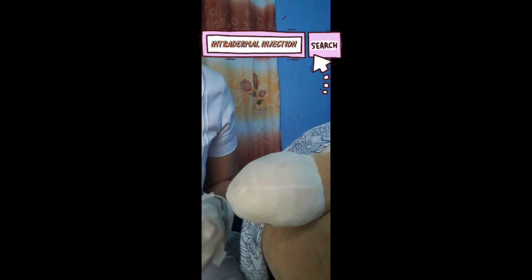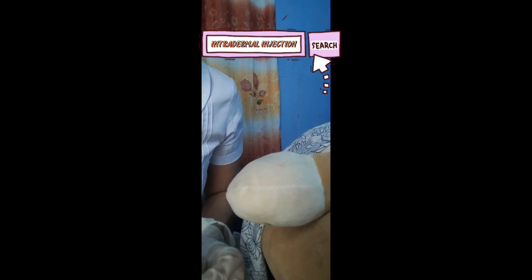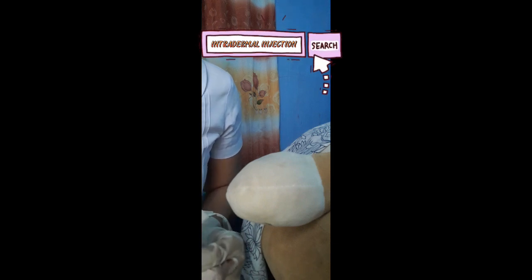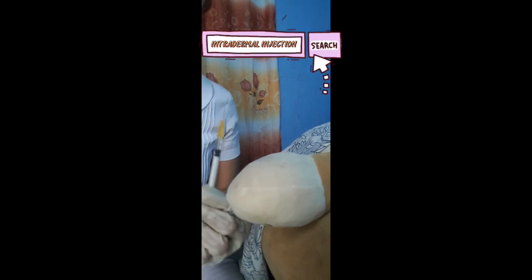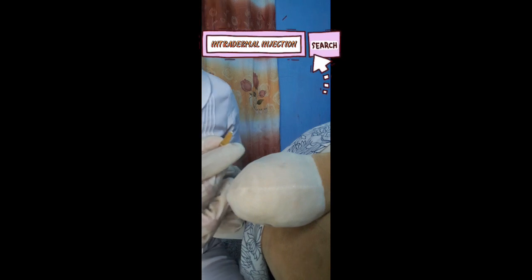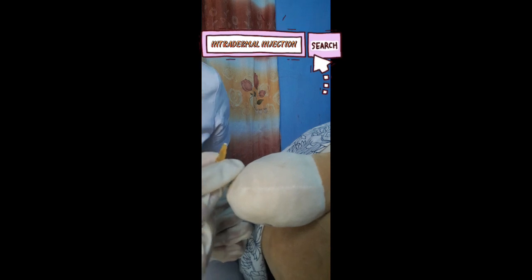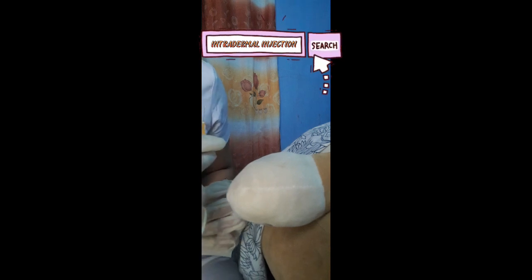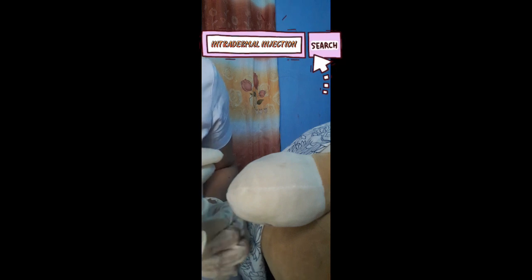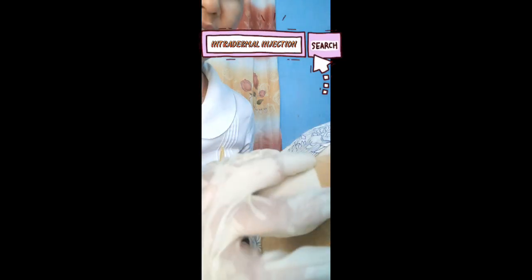Now remove the cap and hold the syringe between the thumb and the forefinger with the bevel of the needle pointing up. Stretch the skin taut gently with the thumb and forefinger of the non-dominant hand. And do not massage the area.